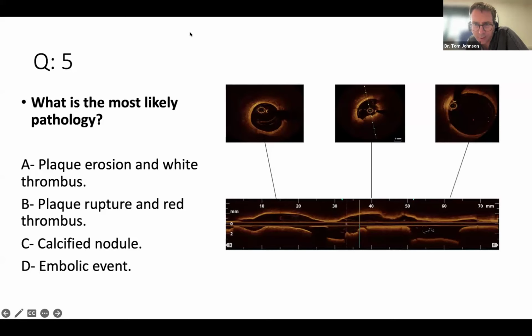And you appear to be representing areas of relatively normal looking vessel. Certainly in that area on the smaller panel on the left, you can see the intima, media, adventitia, certainly close to the OCT catheter from 9 o'clock up to 12 o'clock. And again, just reinforcing that point I made, because there's a little bit of blood within the lumen, and because the vessel from 3 round to 8 o'clock is about 3 or 4 millimeters from the catheter, you've got less resolution.